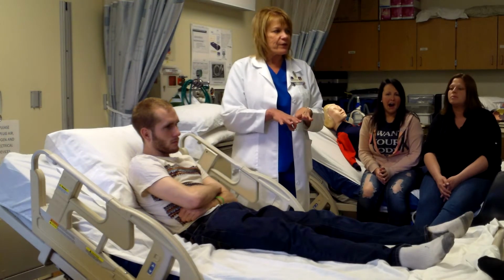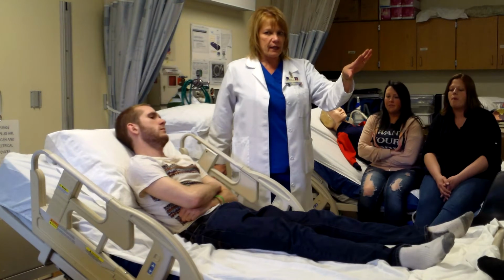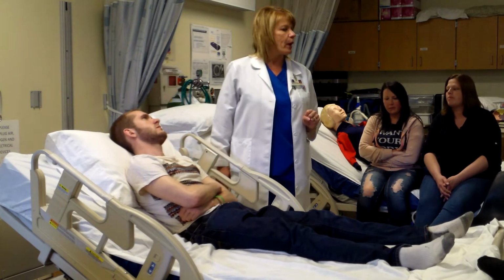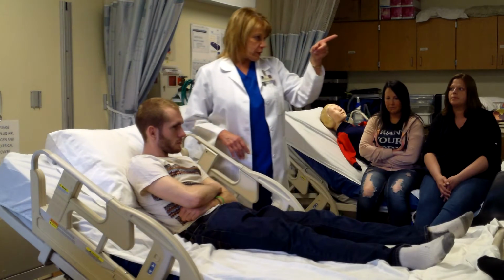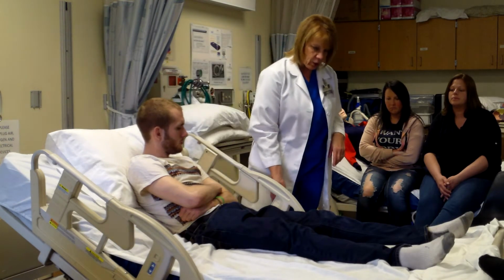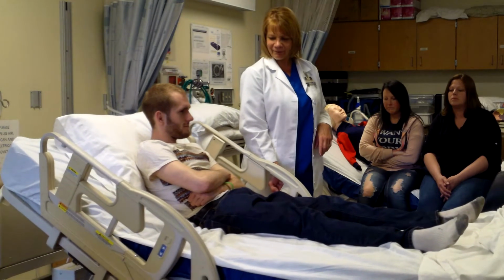So the bed's going to be flat, but the feet are going to be higher than the head. And the patient will be supine, or on their back. So in order to get the bed to do what it's doing in the picture, you have to raise the bed all the way to the top.